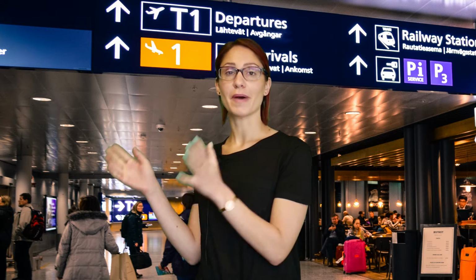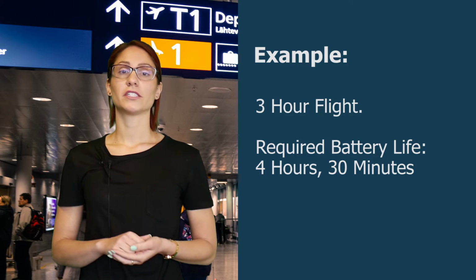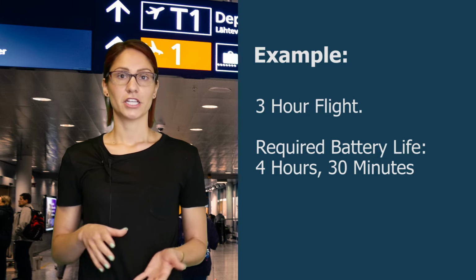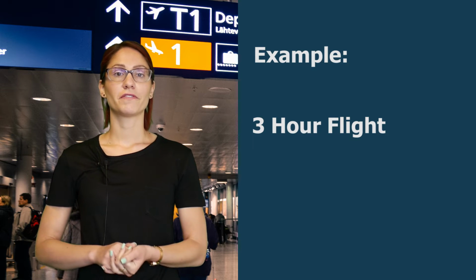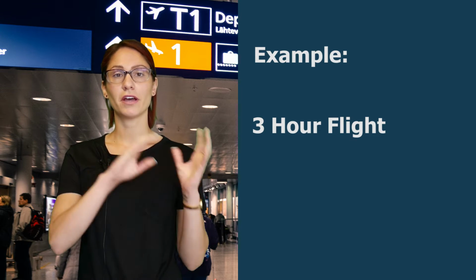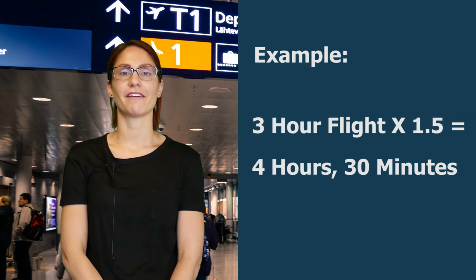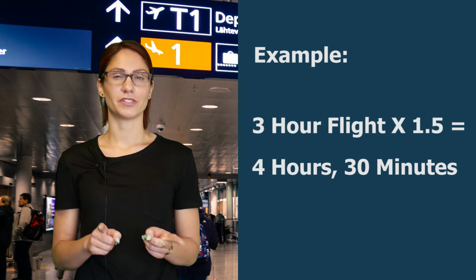Another thing to plan for when you are flying with a portable concentrator is your battery life. Most airlines require you to have 150% of battery life versus your flight time. For example, if you had a 3-hour flight, most airlines are going to require you to have at least 4.5 hours of battery life with you on the flight. An easy way to make this calculation, we're going to do some portable concentrator math here, is if you've got a 3-hour flight, you take the length of your flight, 3, times it by 1.5, you get 4.5. That's how many hours of battery life you need for your concentrator. But remember to check in with your airline because some airlines are different.